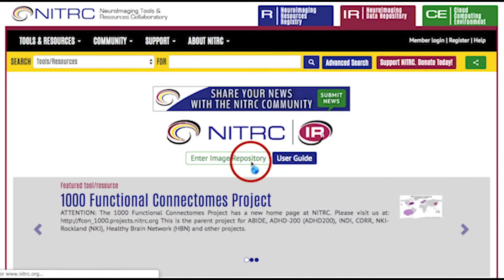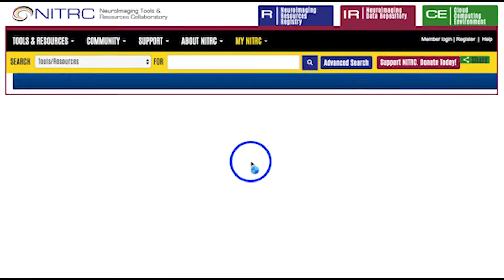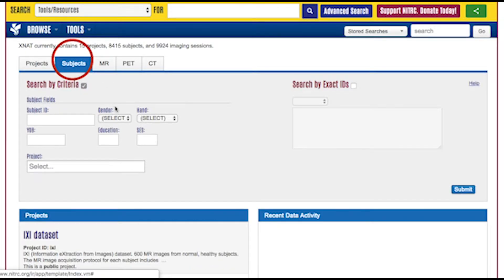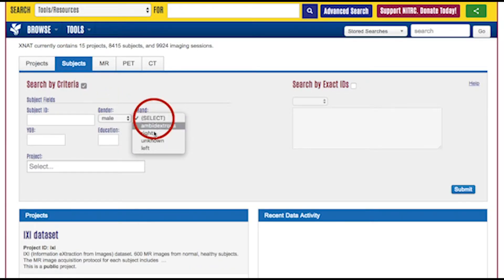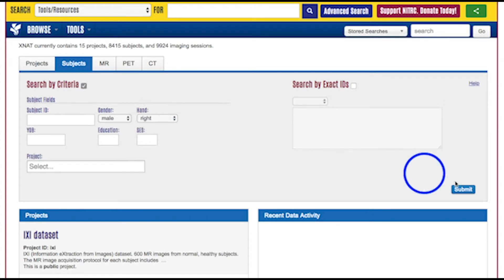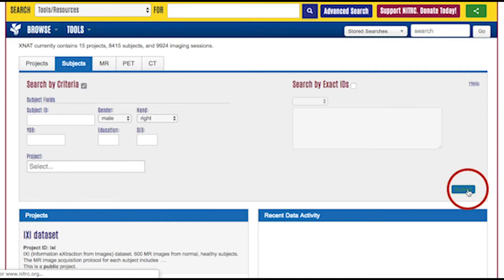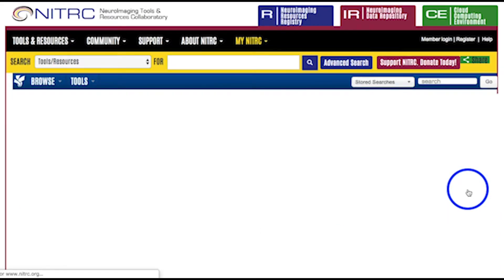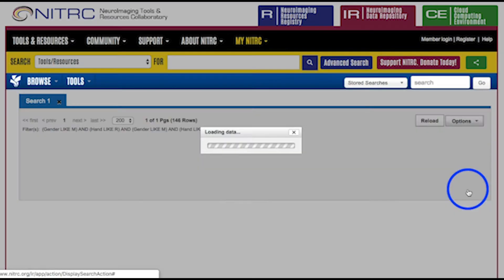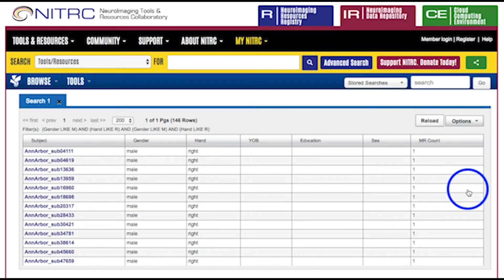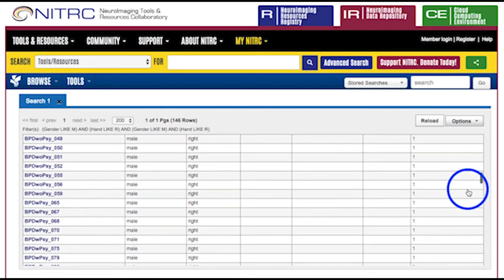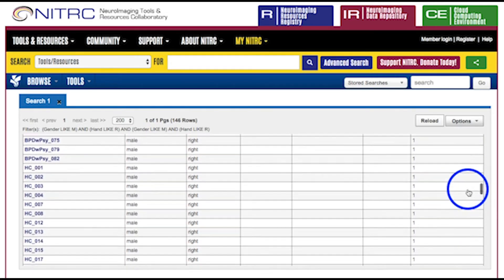Once you've entered the Image Repository, you'll see a list of all the Nitric IR projects. Through Nitric IR, you may search for stored images based on demographics, imaging parameters, and data descriptors. From the search results, you may select and download images.